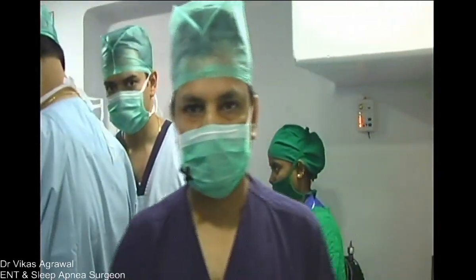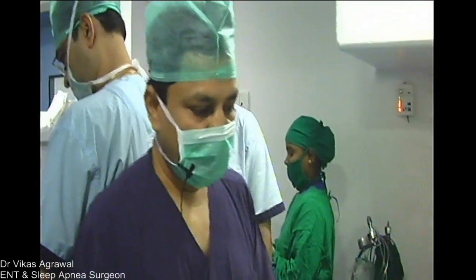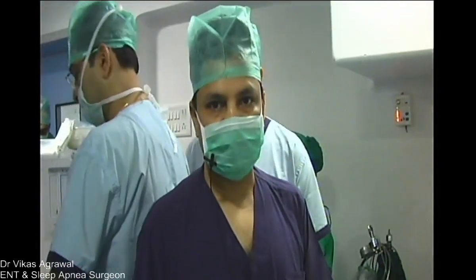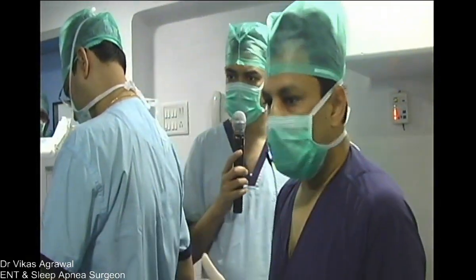100 is the time when the person is fully awake. That means complete brain waves. 0 means no brain waves, that means a dead patient. And at 50, it's the time when you are inducing anesthesia. So at this time we expect the tongue base to fall. Isn't that, Rahul? Yeah, we expect the tongue base to fall.